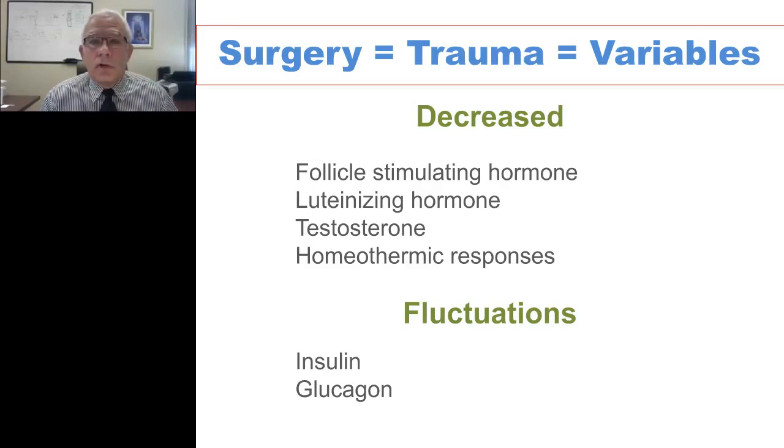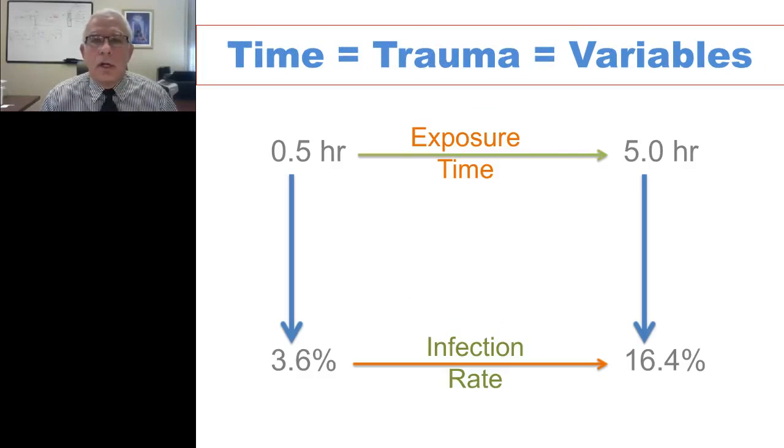Surgery will lead to fluctuations in certain hormones like insulin and glucagon. And so it is important that we understand that time is trauma. The longer an animal is exposed during surgery, the greater the trauma. That's why the focus in good surgical training and practice.